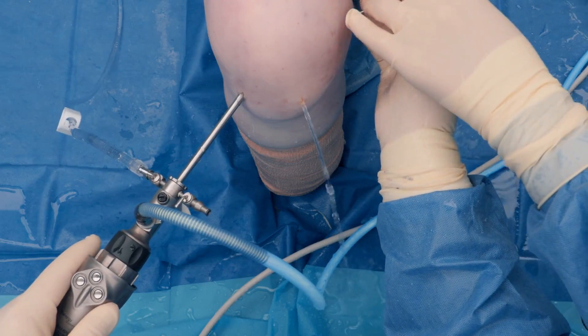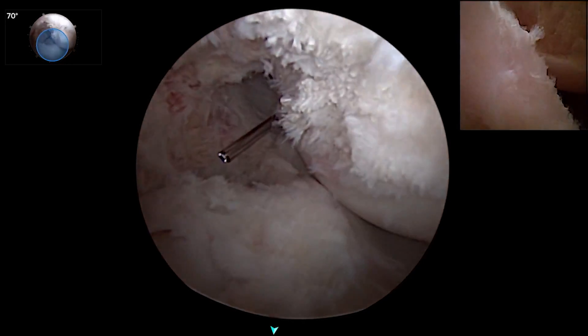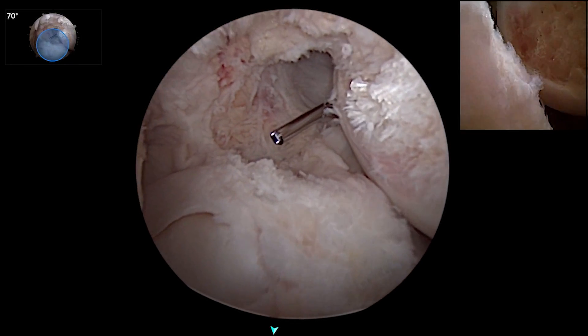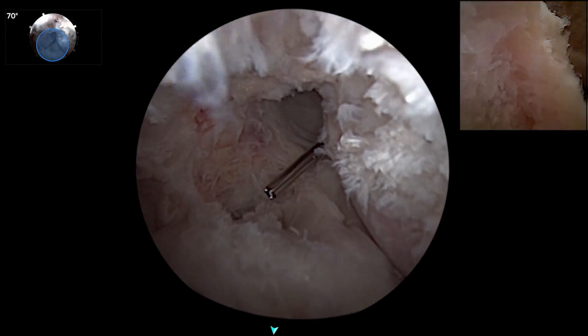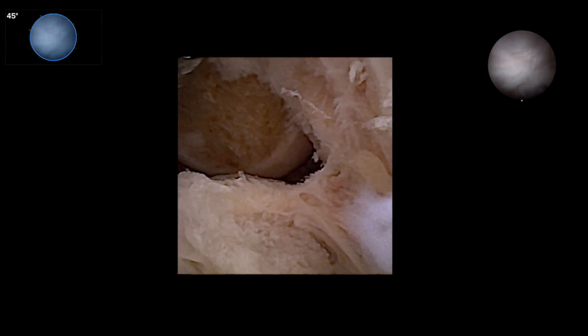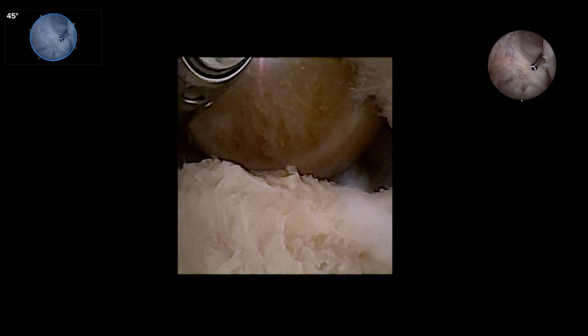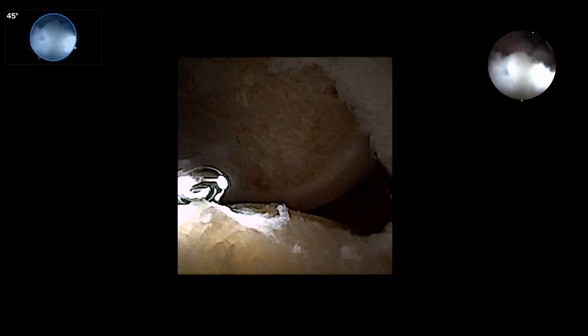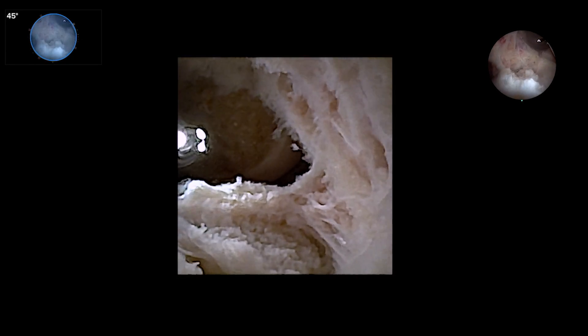Viewing the nano can be hooked into the same console and projected on the same screen, so we can work back and forth from front to back. Now I'm actually looking at the nano, looking at what I want to see down in the back — looking at the PCL fossa and the residual of the tibial stump. My view from the scope in the front is looking back at the nano, looking at the stump of the PCL. You can see the nano come in now, and when we clean this out, this will be a view of the back of the tibia that you don't get to see much for drilling.